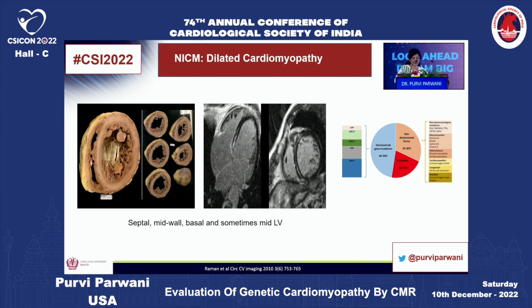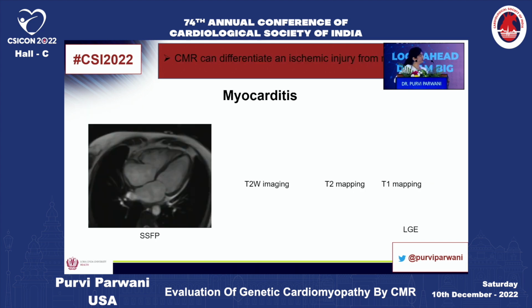Dilated cardiomyopathy: we just had an extensive discussion on left ventricular arrhythmogenic cardiomyopathy, but dilated cardiomyopathy also can have this ring-shaped delayed enhancement because of the genes that are shared by arrhythmogenic cardiomyopathy and dilated cardiomyopathy, and it is truly a complex disease when it comes to management.